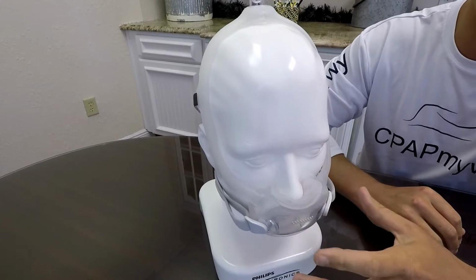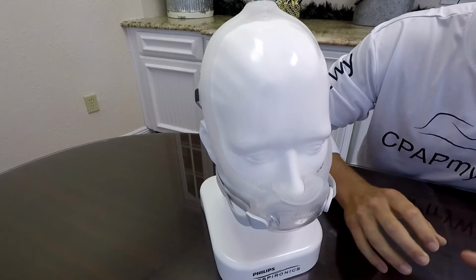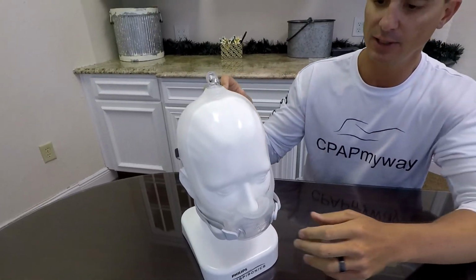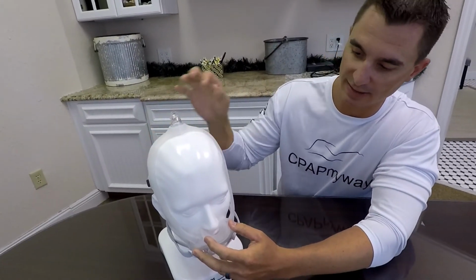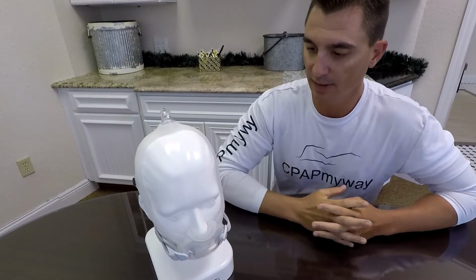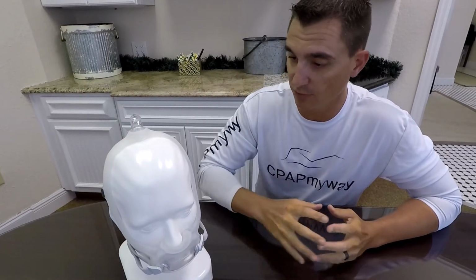The one thing that we have also heard from time to time is that if you're switching from a traditional full face to this minimal contact, breathing through your nose can feel a little bit different, because instead of exhaling into an open space, you're exhaling typically into a hole or a couple of holes that sometimes can feel a little more restrictive. But overall, a majority of our full face users are going for the more minimal style these days.